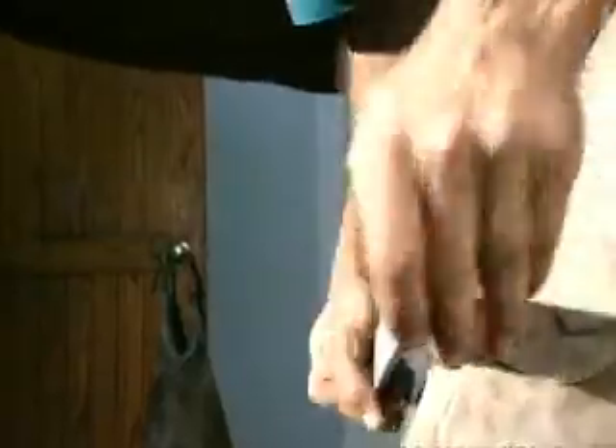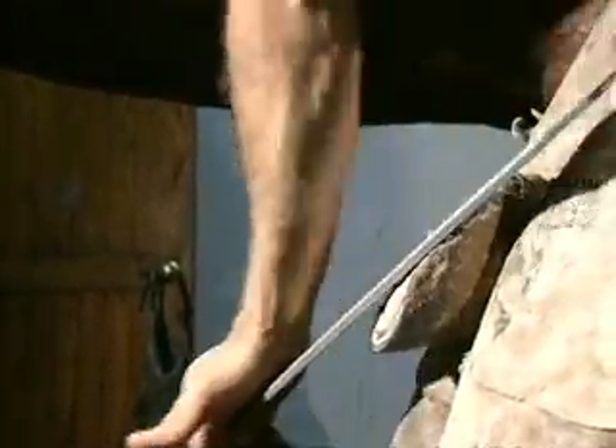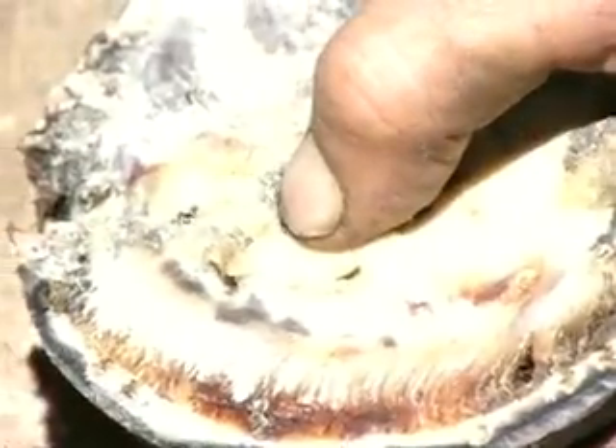She's had many, many abscesses, and she has never really been quite happy. We're going to back the toe off in the same fashion, not invading the sole as it lies over P3. It's quite important to back the heels up, basically to the widest part of the frog. This is the derotation process.